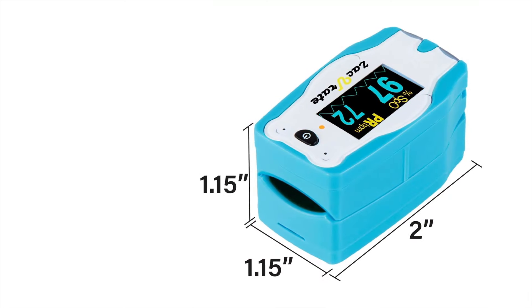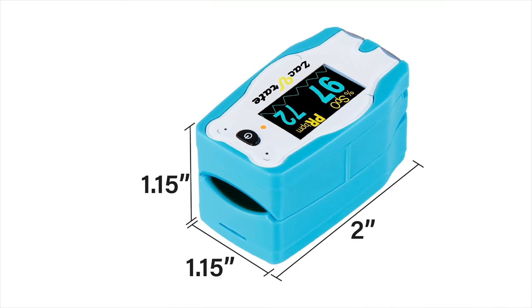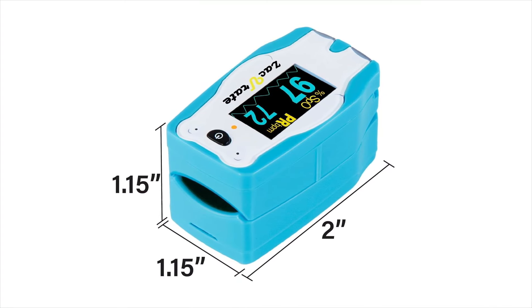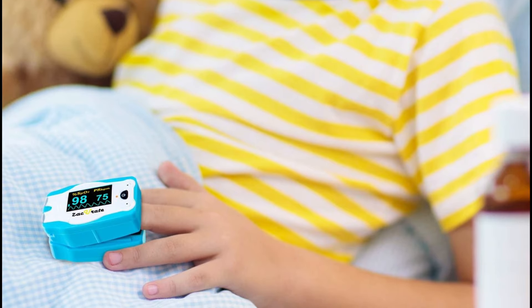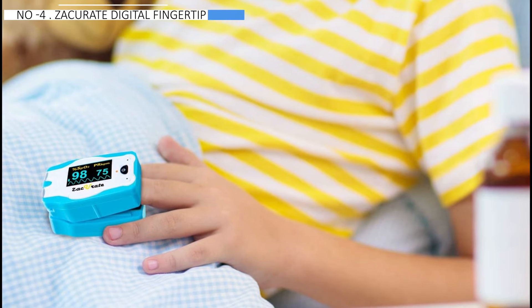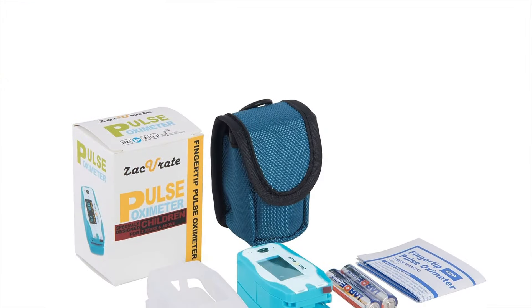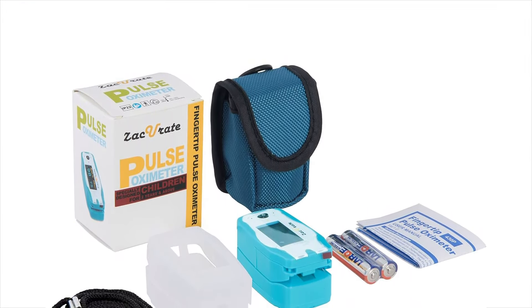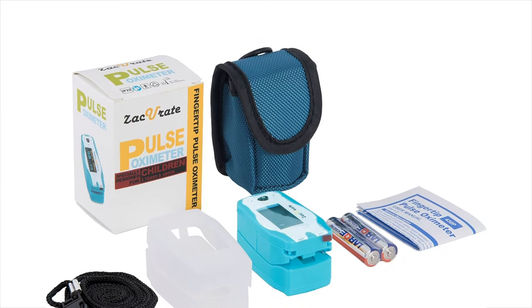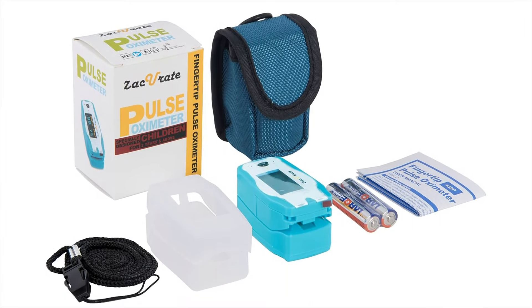The device includes a waveform to assess the consistency of blood flow, ensuring accurate readings. Due to its design for child-size fingers, the Zaccurate may struggle to register adult fingers, although its readings are consistent and accurate when it does. Overall, the Zaccurate Children Digital is recommended for monitoring children's oxygen levels, while the Nonin Onyx Vantage 9590 is recommended for general use and was the top performer in accuracy tests.